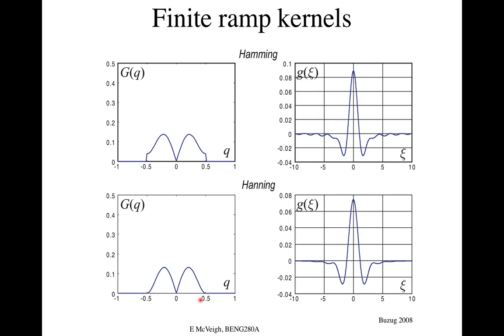Nowadays, a lot of this is also being done with deep learning. And so the whole way that filter is going to work depends on the data that you feed it. Those reconstructions will be dependent on what the filter was that went in to give it the truth.